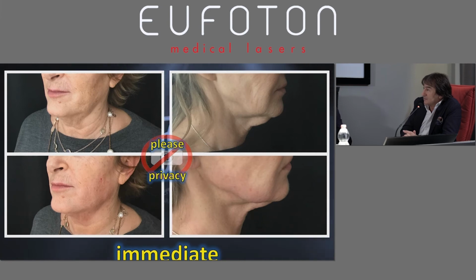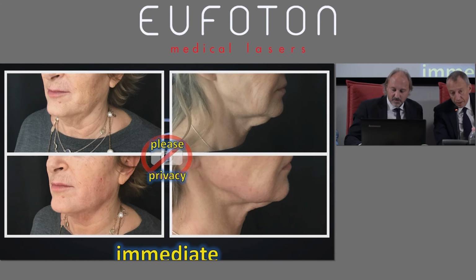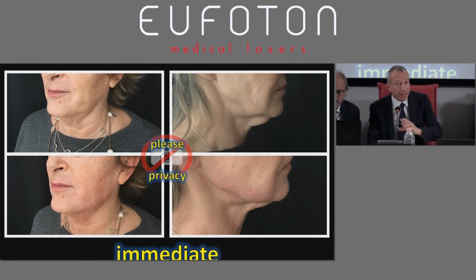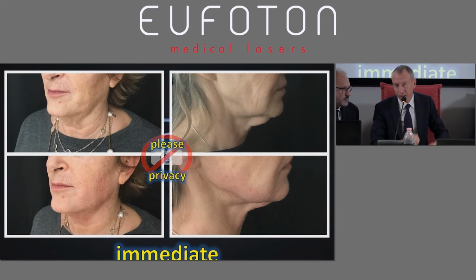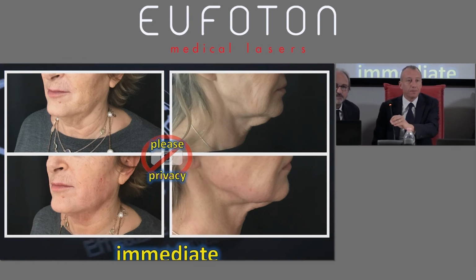I also use the CO2 fractional laser in the same session. CO2 laser can be more impactful, but we make this sandwich effect with the Endolift and then the non-ablative fractional laser. So we need a different setting, which is not the one of Endolift. So 3 sessions, 2 or 3 months apart from one another. For the periocular region, fractional laser is fantastic.